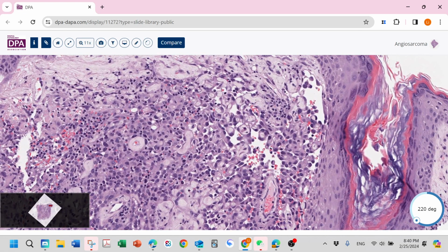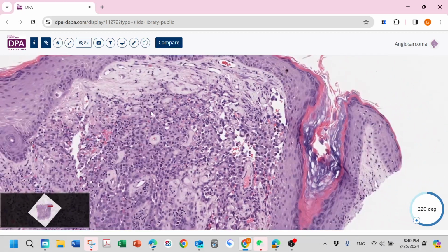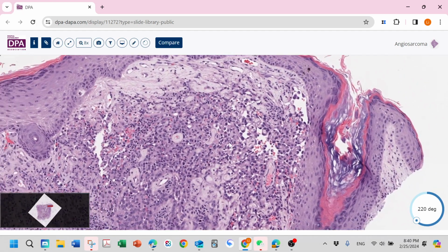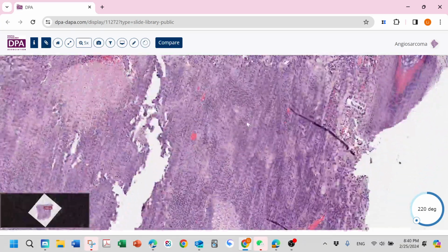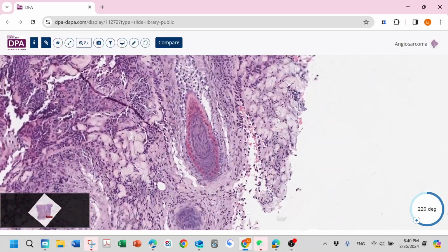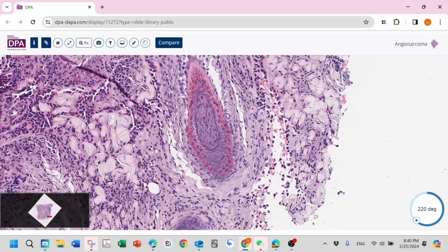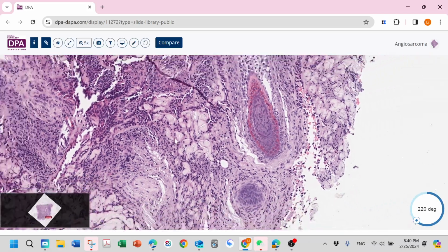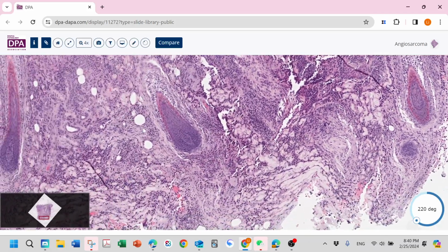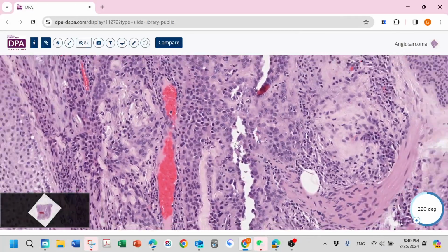Some epithelioid angiosarcomas may also be CK positive, so you need to be careful. When you do CD31 and ERG, they should be strongly positive. See, they're going really dark into the subcutaneous fat, forming this and dissecting this collagen bundle, forming this characteristic structure. So this is another really nice classic angiosarcoma.